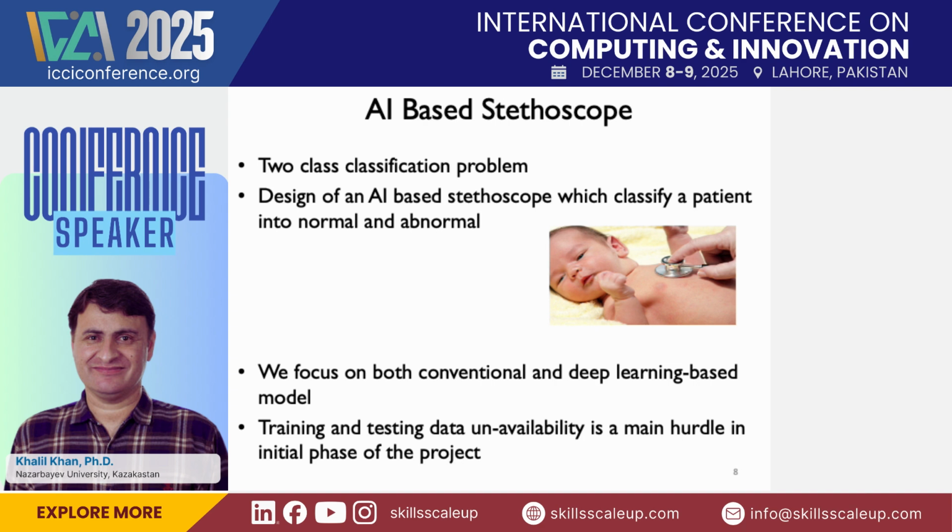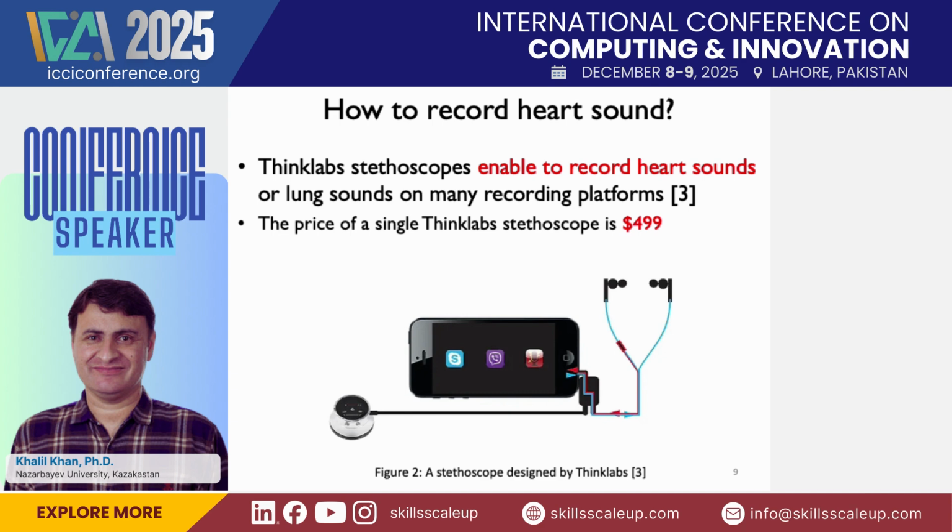What we actually tried is that we develop a stethoscope, and we put the stethoscope on a baby's heart, and the stethoscope tells us whether the baby is normal or not normal. That's it. I mean, just classifying based on the PCG sound, based on the murmur of the baby's heart, whether the baby is normal or not. Now, when we started research on this problem, we noticed that to train a model I need training data, and there are no free data sets available in the literature. So we contacted some of the hospitals in Pakistan.